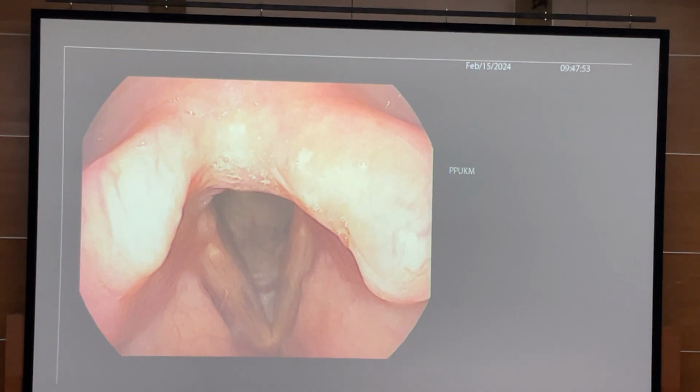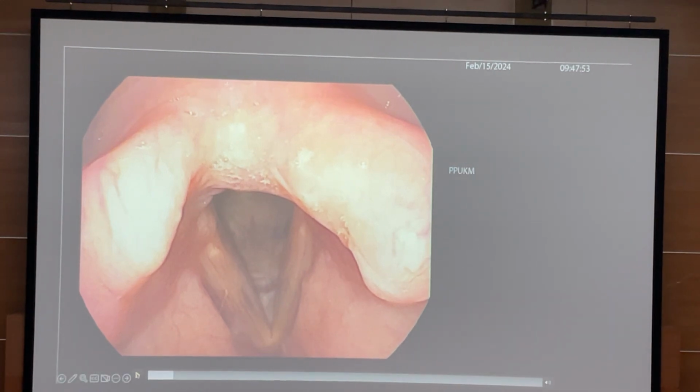You have to bring the camera as near as possible to the vocal fold for you to see any structural issues. For those sitting for the exam, don't just do a drone examination. Drone meaning you put the camera at the tip of the epiglottis and say, okay, it's normal. We wouldn't put any normal cases in the exam. There must be some findings. So you put it at the tip of the epiglottis just to see the panoramic view and to assess the mobility of the vocal fold. And when you're happy with that, you have to go near to see any structural abnormality.